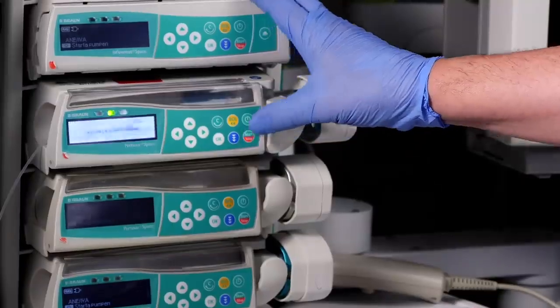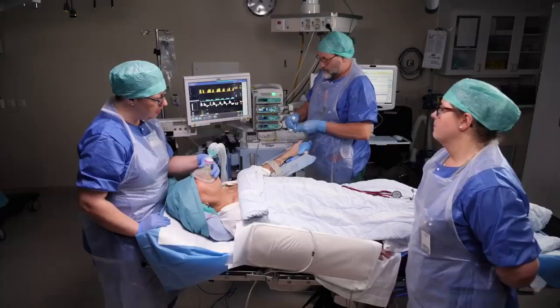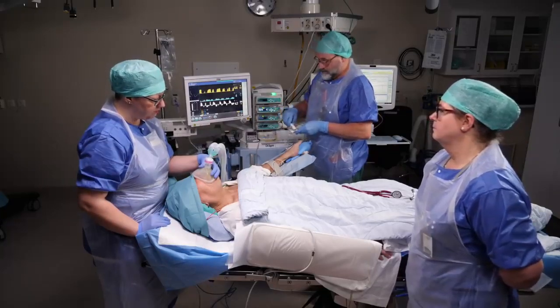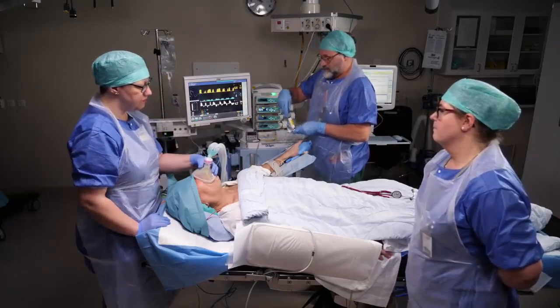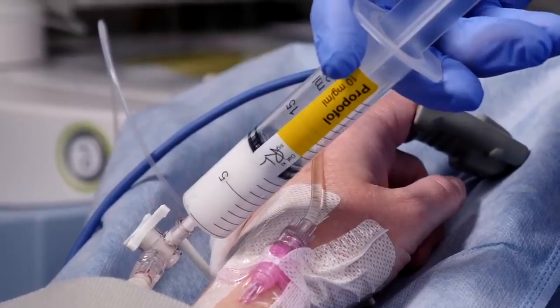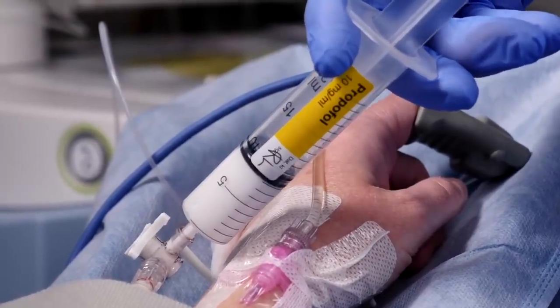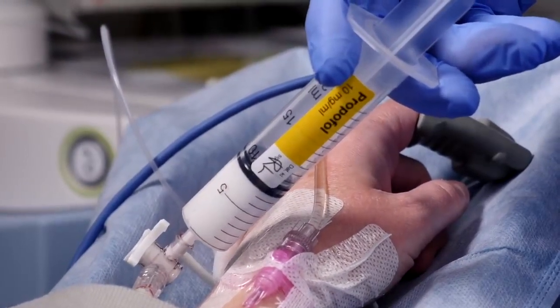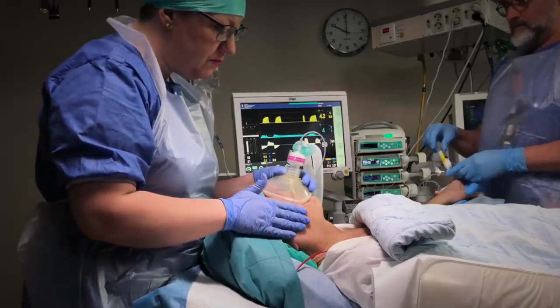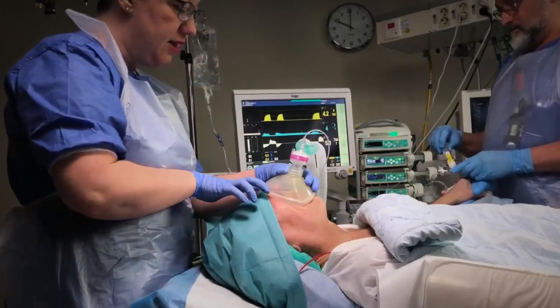Administer the analgesic and await the onset. Laryngoscopy is very painful and requires drugs to alleviate sympathetic response and airway reflexes. Next, administer the hypnotic. The patient gradually loses consciousness, airway muscle tone, and respiratory drive. From this point on, the patient's breathing is your responsibility.